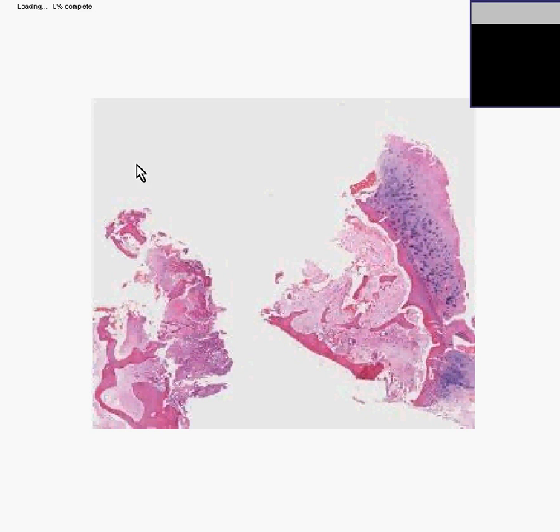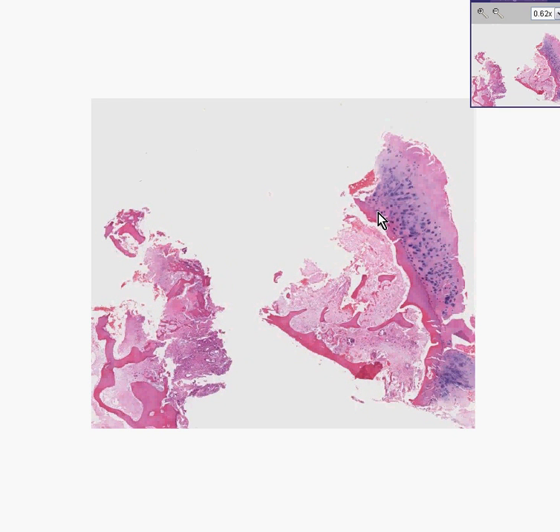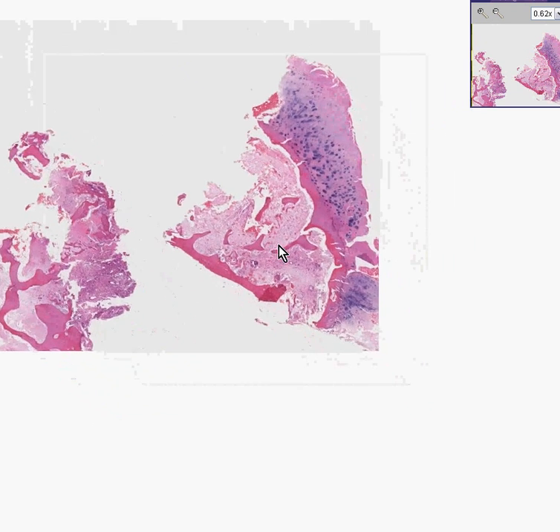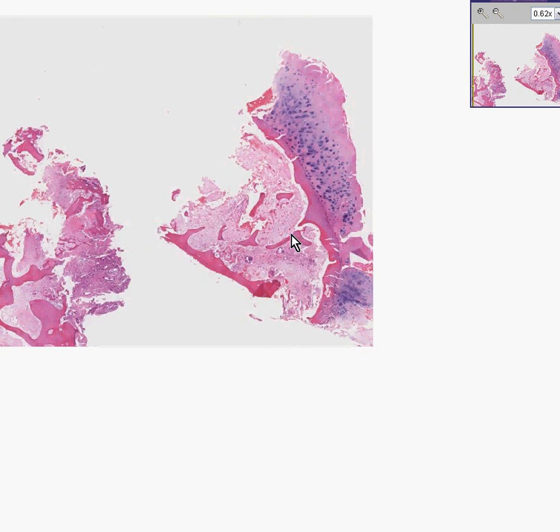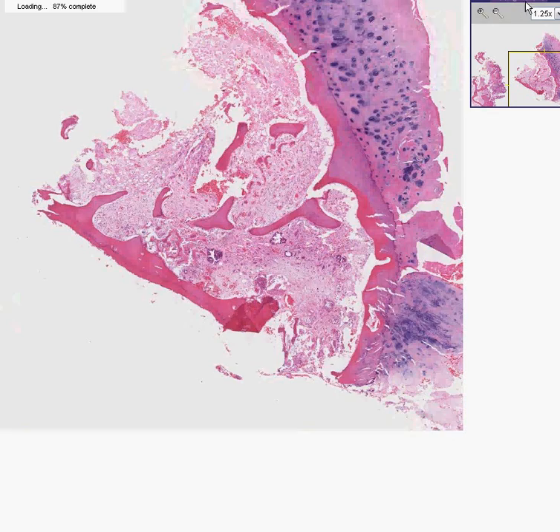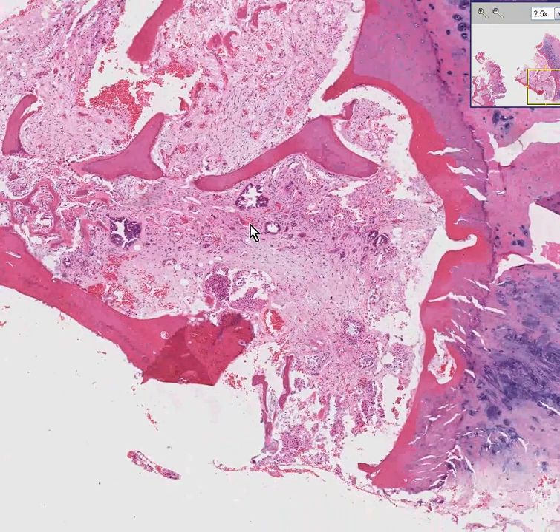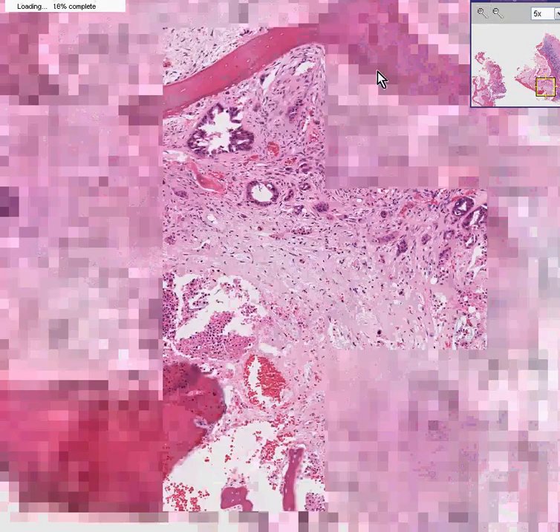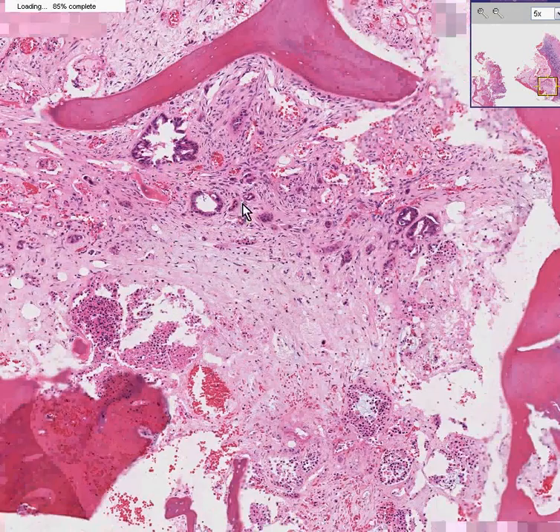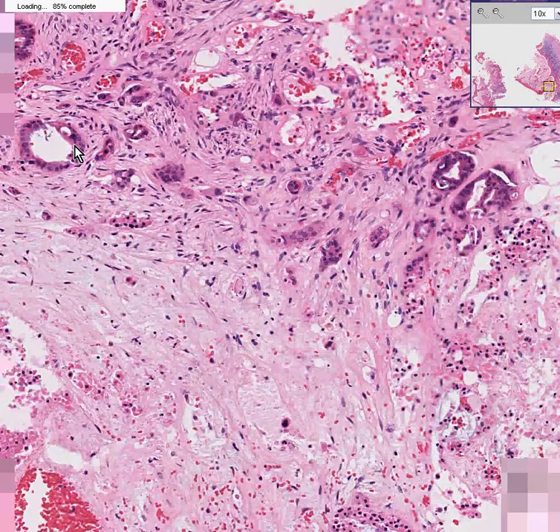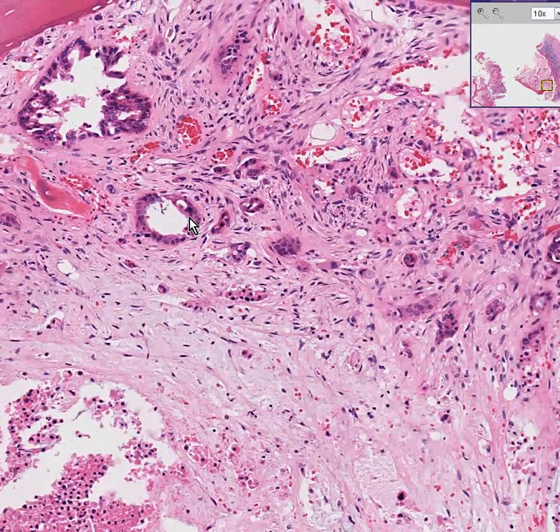Now I will show you the microscopic appearance. You can recognize this as bone instantly, and perhaps this as surface or articular cartilage. Notice that there is not much marrow or fat between the medullary or spongy bone — instead it is mostly fibrous tissue. More importantly, in the middle of that fibrous tissue are glands. Normally, there should never, ever be glands within bone marrow.